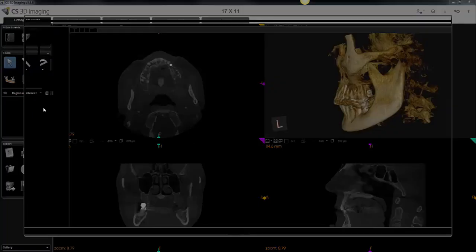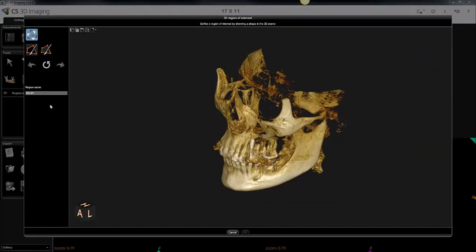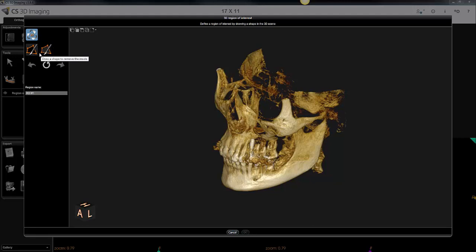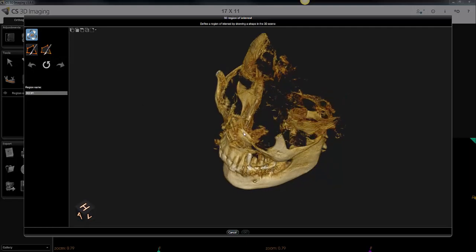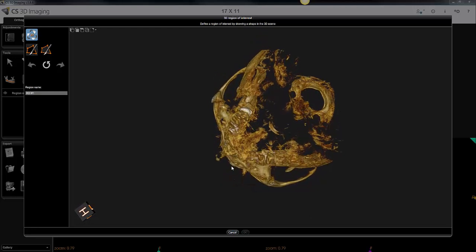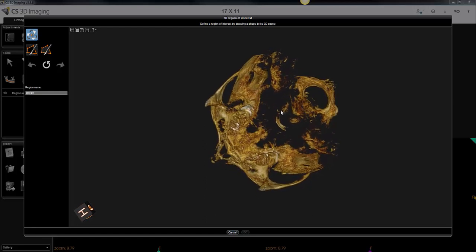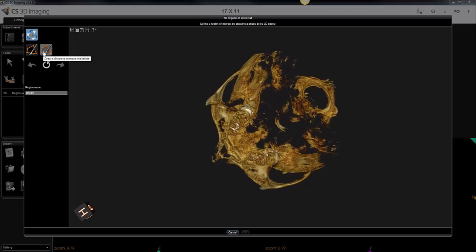I'm going to create a 3D region of interest. When you click on that icon it will open up the 3D rendering in a separate window and you'll have these two tools to choose from. Before you choose one of these two tools you want to change the orientation of the rendering so that you can visualize what you want to remove. Then you choose the tool that you want.